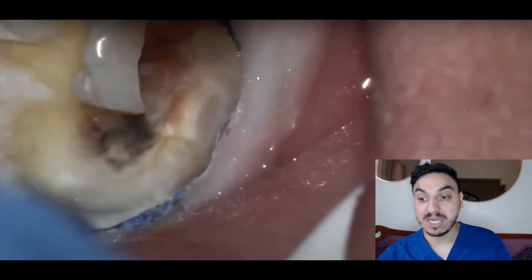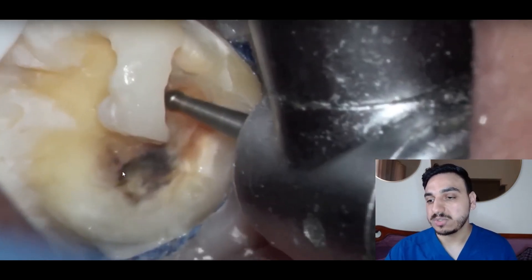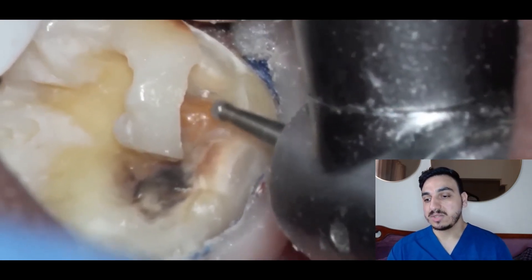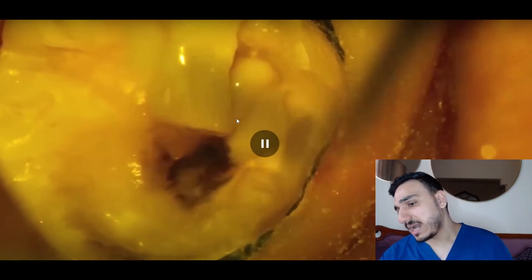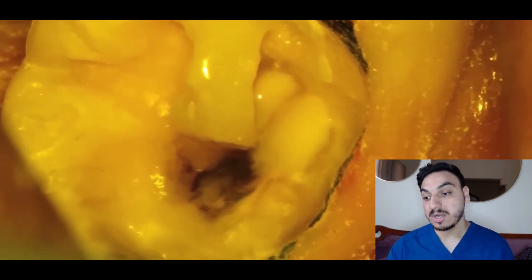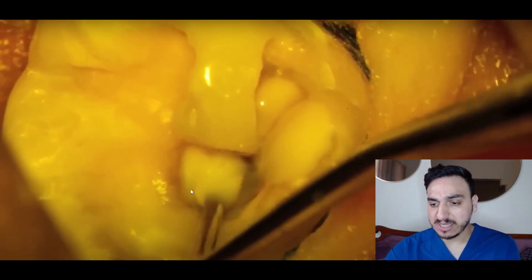You can notice there's a cord inserted into the gum line — that's called the retraction cord. A retraction cord is inserted into the gums to help retract them, preventing the dentist from harming the gum tissue and serving other functions to make the procedure easier and reduce the risk of damaging the gums. The gums can bleed very easily because they have a very rich blood supply — in fact, the reddish color of the gums is largely due to that blood supply.